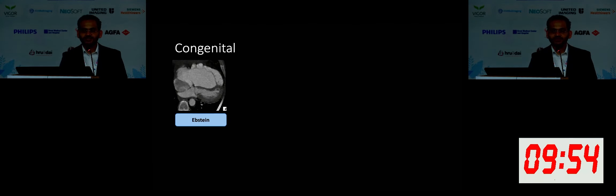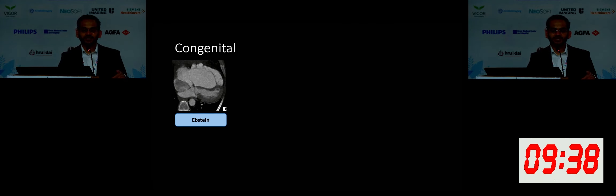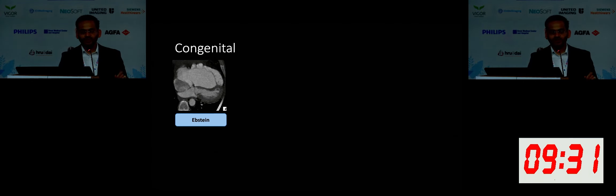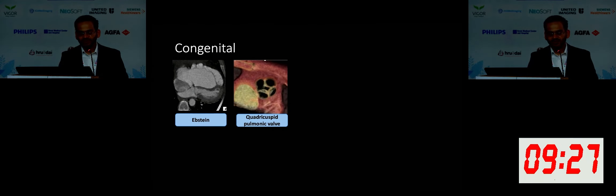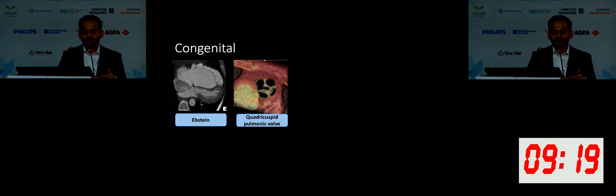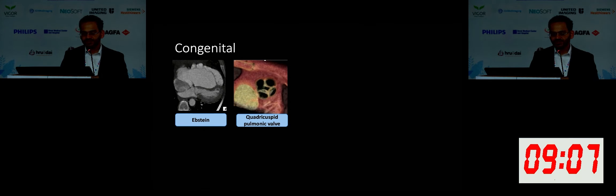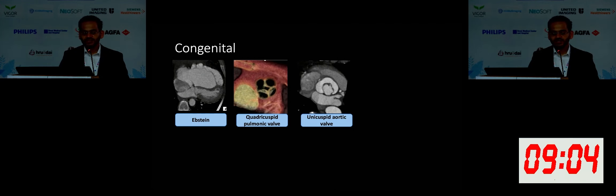Let's start by seeing some case examples. Here's a case of congenital disease — this patient has Ebstein's anomaly. Typically there is apical displacement of the septal leaflet of the tricuspid valve and atrialization of the ventricle. If this is a pediatric patient, you want to know if the mother had lithium intake during pregnancy. An example of another congenital valve abnormality is quadricuspid pulmonic valve. These types of abnormalities are rare. When you acquire multiphase reconstructed images, you are able to see if the valve is coaptating well and whether there is stenosis or regurgitation.